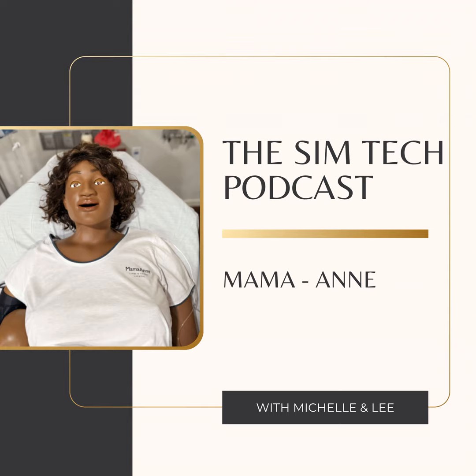Can I just ask you what the seizures are like there, Lee? Because obviously sometimes our seizures can be a little underwhelming. Sometimes we don't even get noticed. What are the seizures like? I get what you say. Sometimes, particularly on Simman, depending on if they're not looking at the arm, it's literally just the hands that shake. Yeah, it can be, but this is more of a fuller body seizure. So even for somebody like me with a first aid badge, I can notice that it's seizing. It's definitely more of a fuller body seizure rather than just the arm shaking down the side.